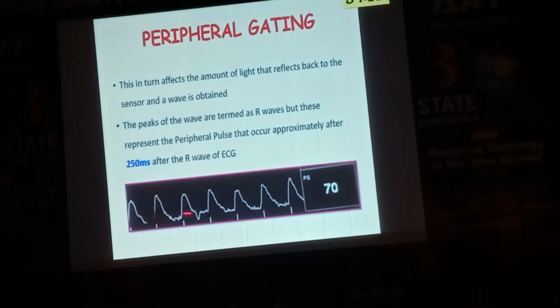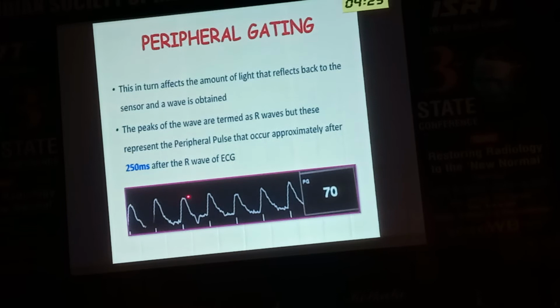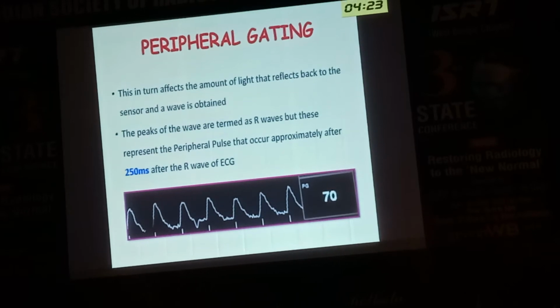and that will be displayed as a graph. See, can you see, this is the maximum blood flow in the capillary. Then it comes down, rest phase, increases, rest phase, similar to ECG.